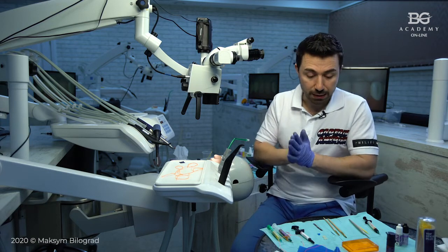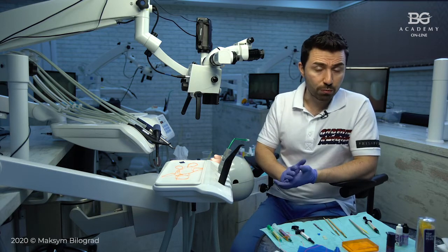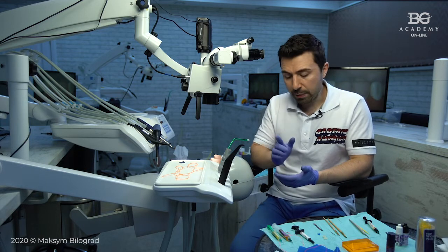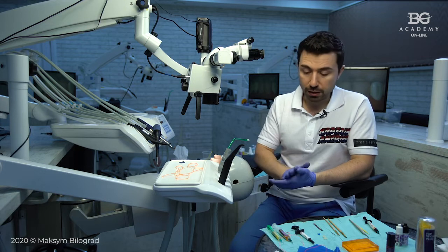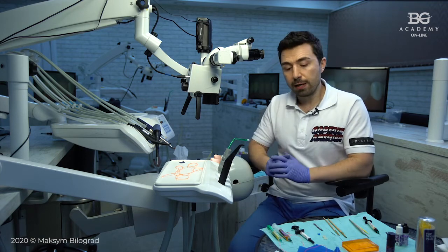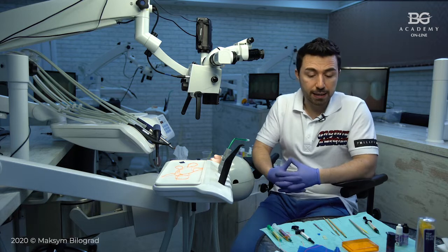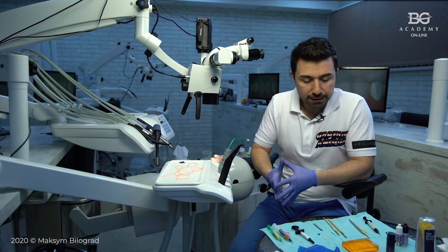Now we will do it step by step, just to make every step really clear, very understandable, and repeatable. I will use the classic adhesive protocol for ceramic luting. We have to etch the ceramic with hydrofluoric acid. This is the rule of the classic adhesive protocol. In this case, we have to understand what type of ceramic we have to bond, and what type of hydrofluoric acid to utilize.